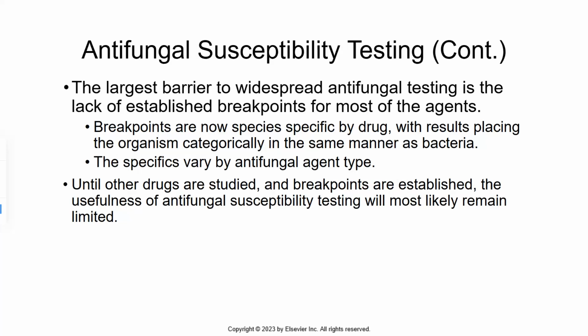The largest barrier to widespread antifungal testing is the lack of established breakpoints for most of the agents. Breakpoints are now species-specific by drug, with results placing the organism categorically in the same manner as bacteria. The specifics vary by antifungal agent type. Until other drugs are studied and breakpoints are established, the usefulness of antifungal susceptibility testing will most likely remain limited.